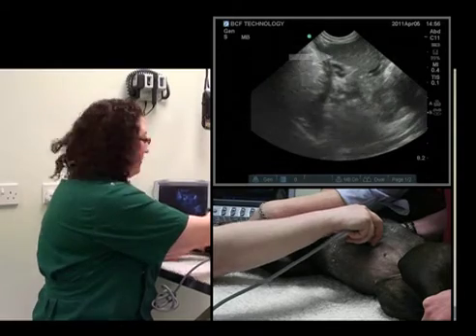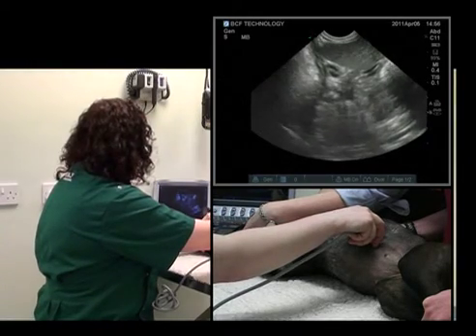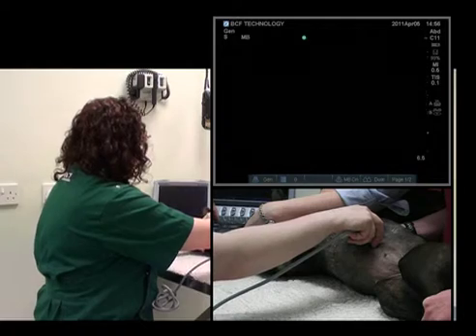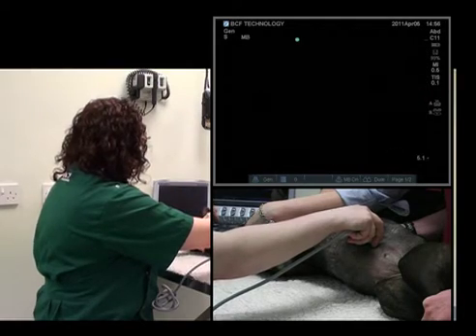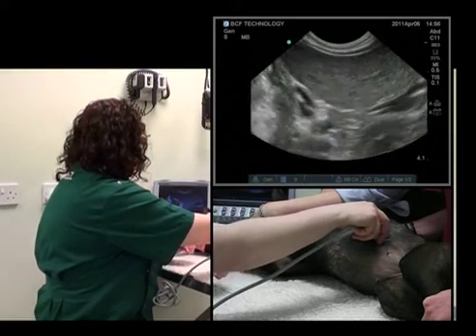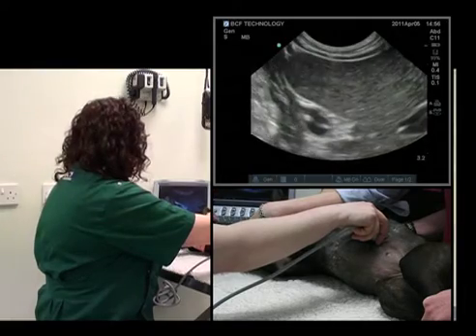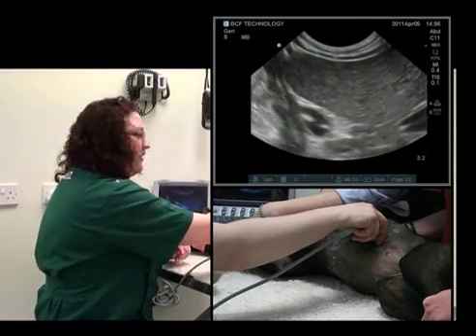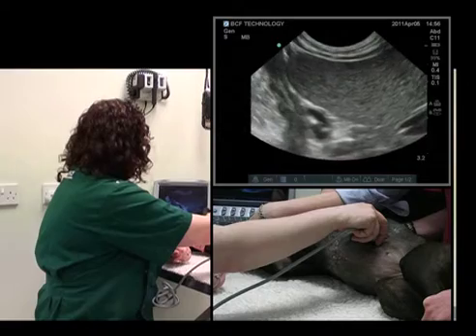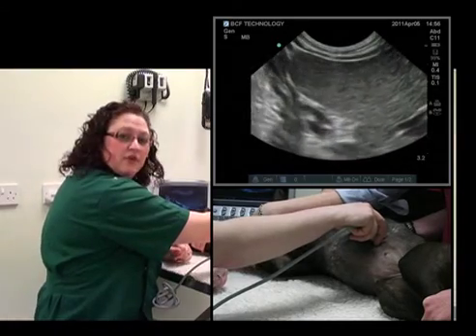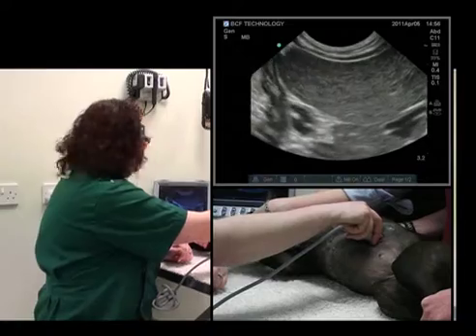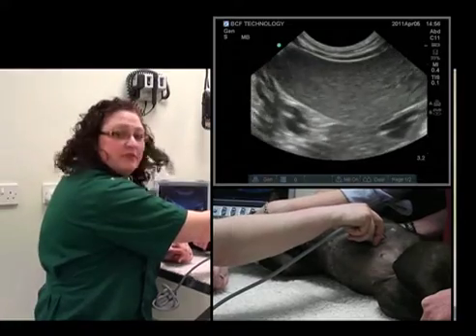First off, we'll start with depth. And that's occupying about three quarters of the screen. Looking at overall gain and time gain compensation, it looks pretty good, so we'll leave those alone.